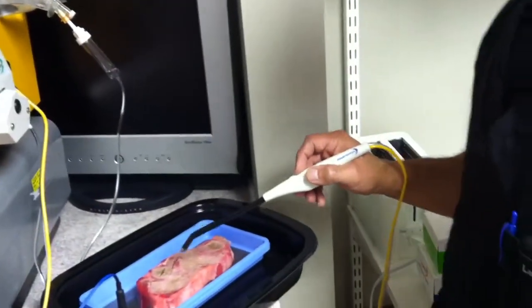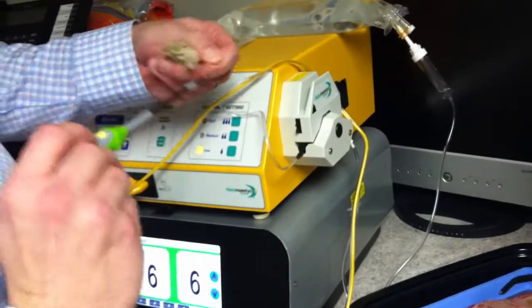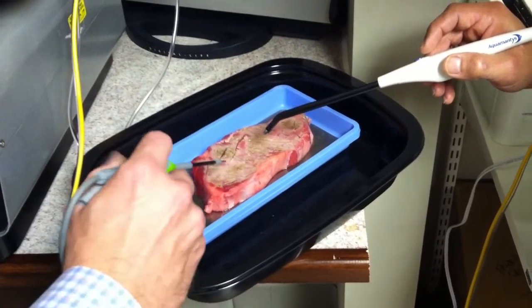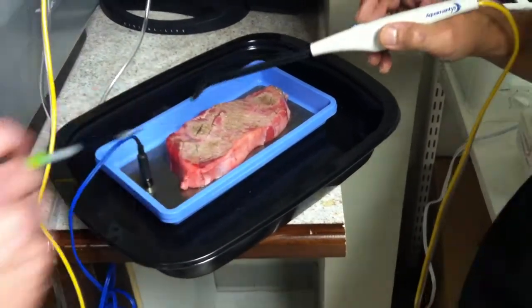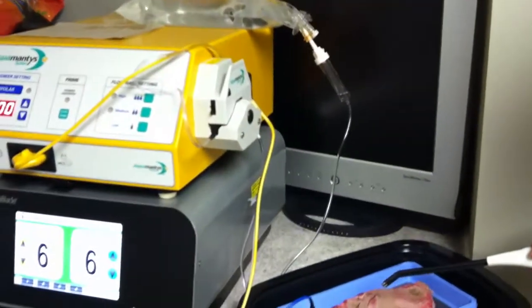So there's a little bit of fluid on here. You can see there. And remember, just the tip is exposed here, just the periphery of the tip. So your coagulation technique's a little bit different. You kind of paint. But you see it, there's lots of water, lots of saline there, and it still operates just fine. Interesting. Yeah, the technology was developed for use in eyes.